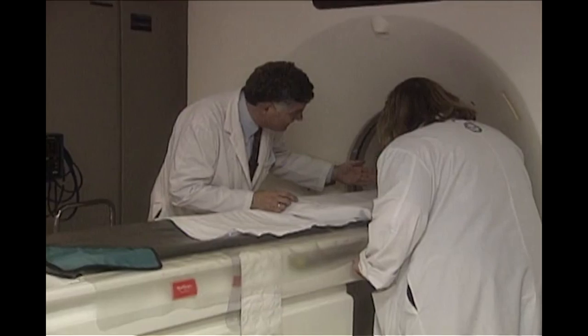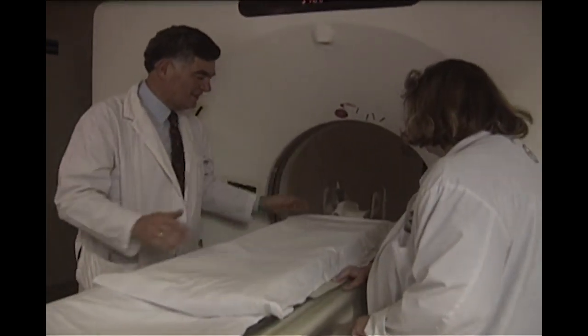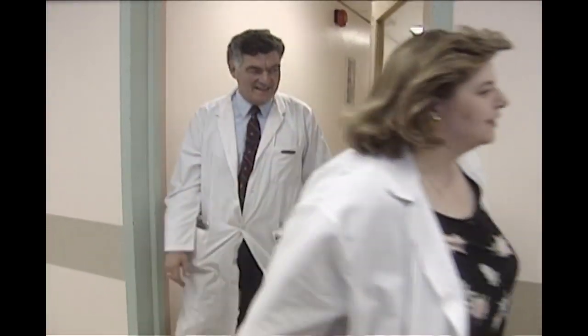How could Dr. Lewin see into the life of this mummy and learn why she died without desecrating the sanctity of her death? X-ray technology, known as computerized axial tomography, or CT scanning, was the answer to Lewin's dilemma. The machine produces cross-sectional images of the body without touching it. When the slices are stacked together, a three-dimensional image is rendered. Dr. Lewin was assisted by CT technician Stephanie Holoka.